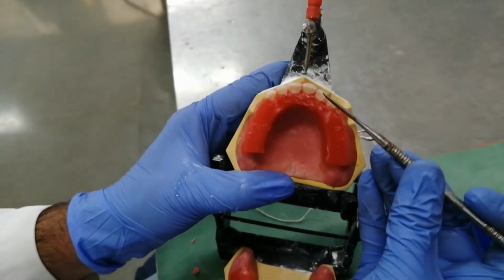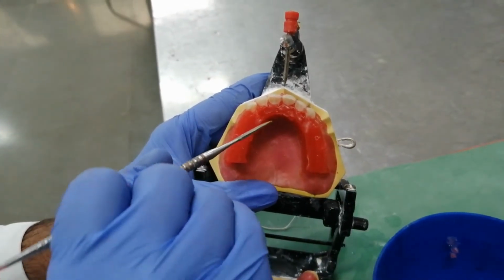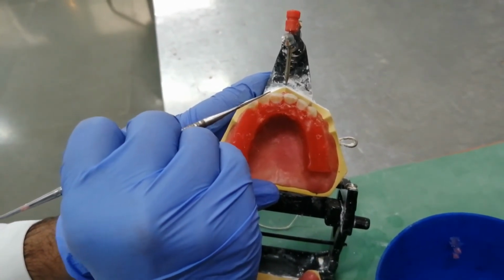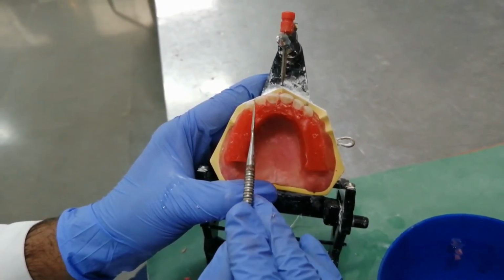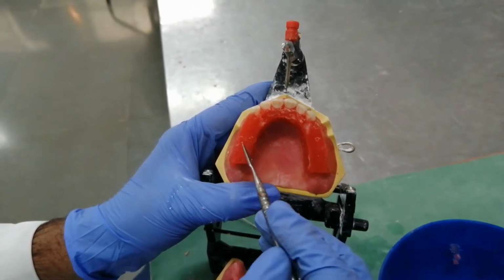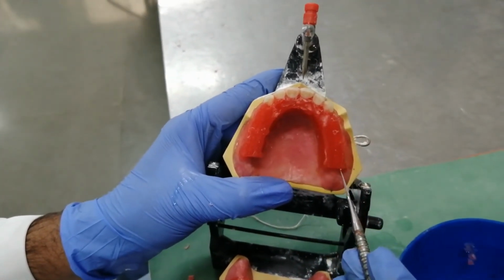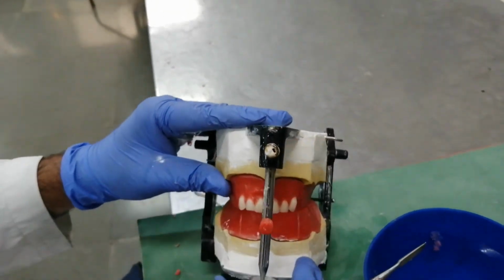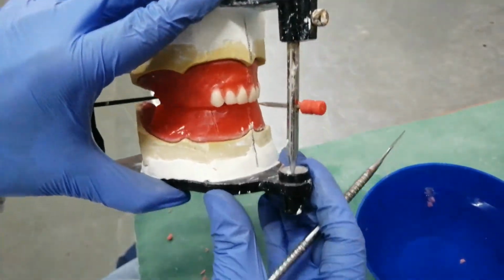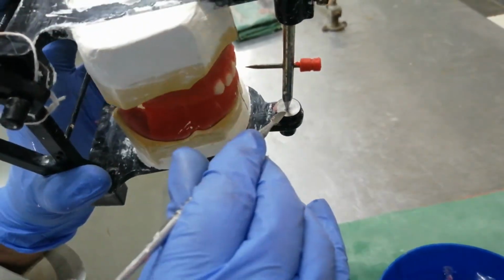Central incisor, lateral incisor and canines are following the arch form. Simultaneously, vertical rod should touch the incisal guiding table.